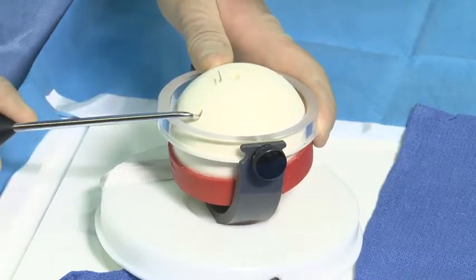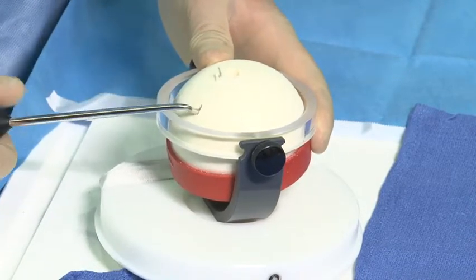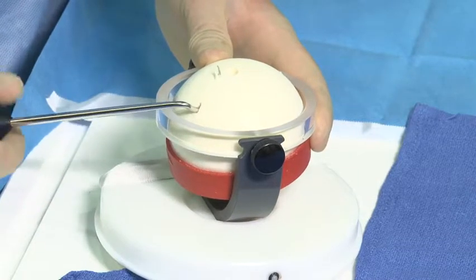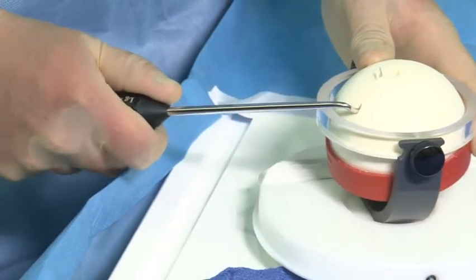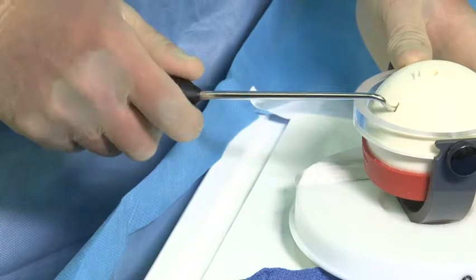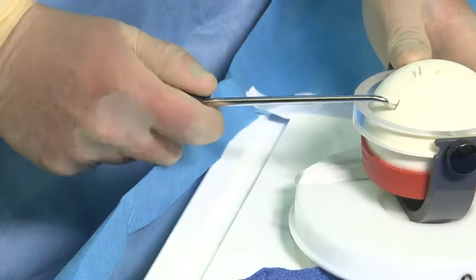Once the passage through the bone has been created, the Moses hook should be utilized in a forward and backward twisting motion. The forward and backward twisting motion chamfers the tunnel to create a very nice smooth passage for the next device.